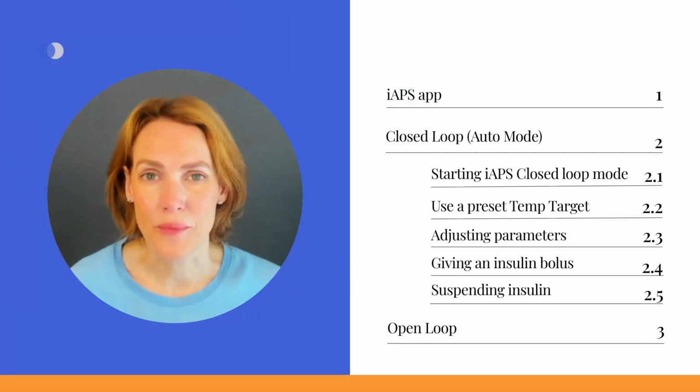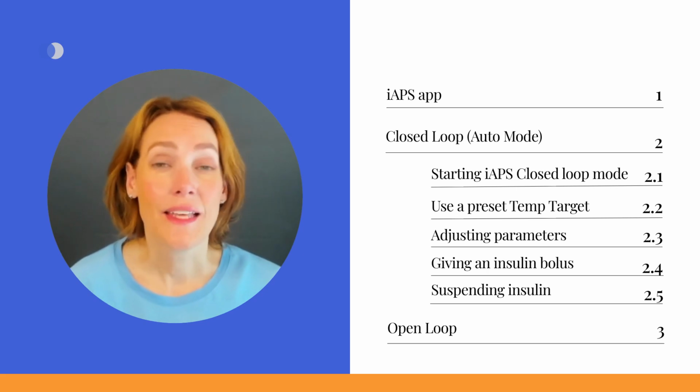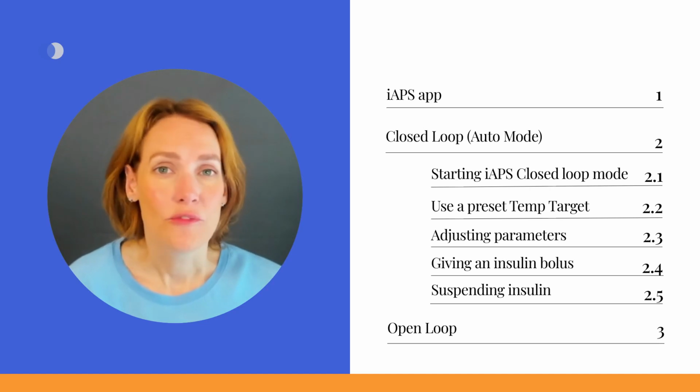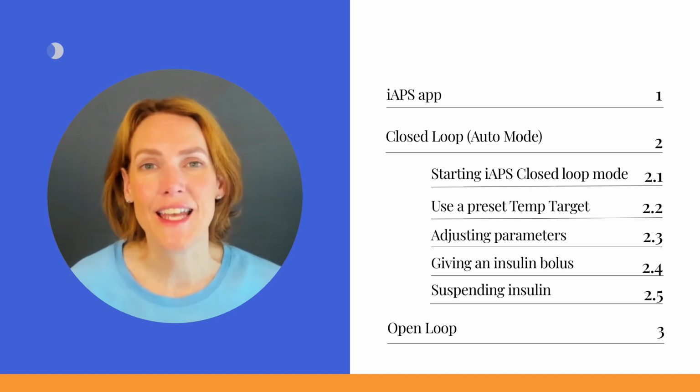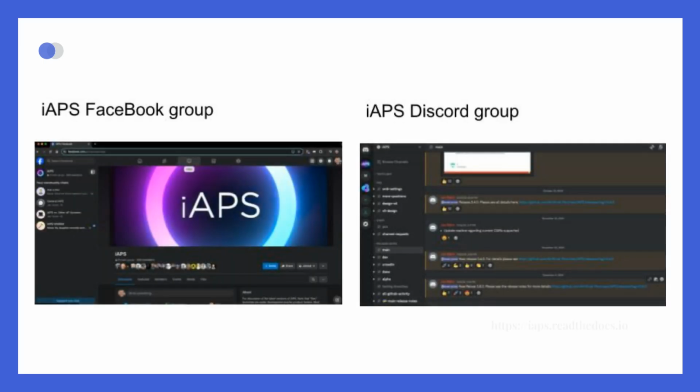In conclusion, iAPS offers a lot of additional settings on top of the core settings from manual mode. It's best to experiment with the app in open loop and go through the documentation before closing the loop and using advanced and dynamic settings. While it may seem daunting to adjust the system yourself, it is important to remember that you are not alone in this journey. The iAPS community is there to support you every step of the way. So have confidence, seek help when needed, and refer to the extensive documentation as you work towards achieving optimal glycemic control with iAPS.